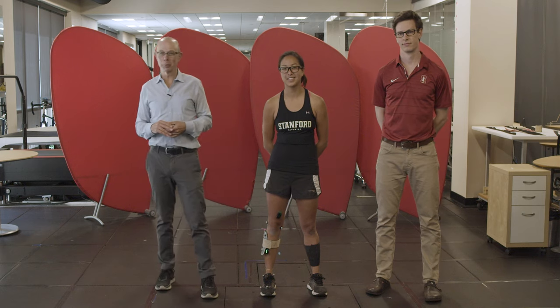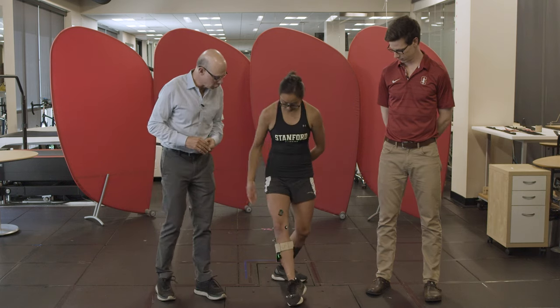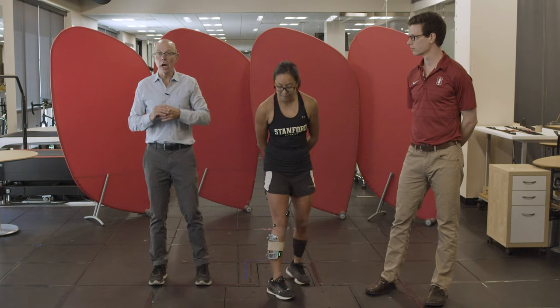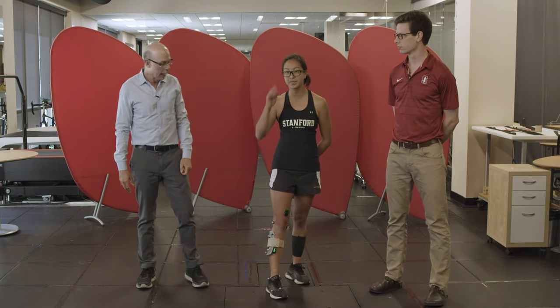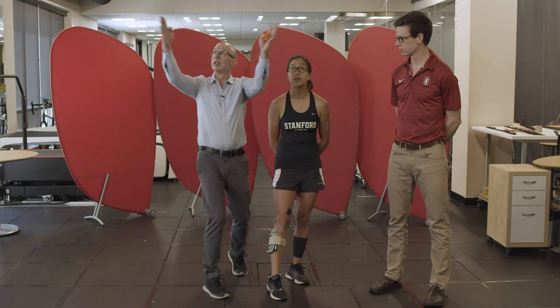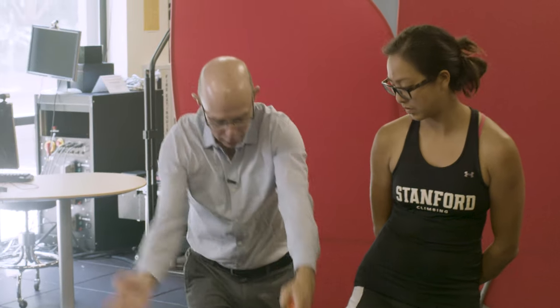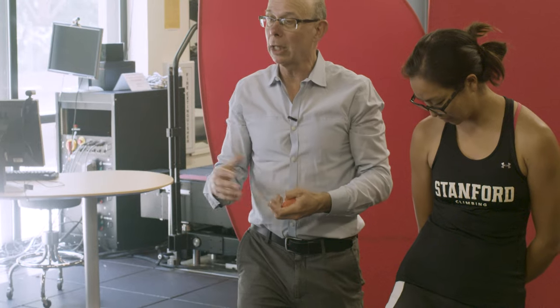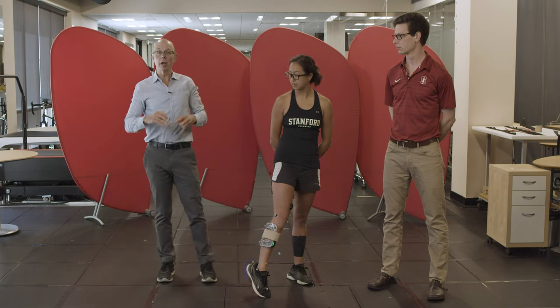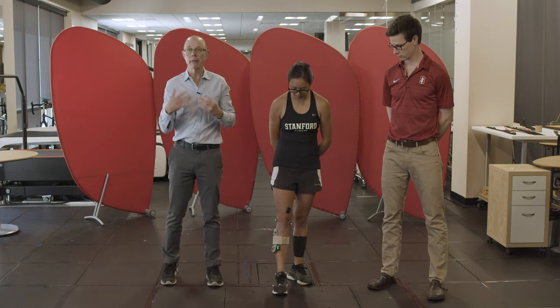We're going to do an integrated motion capture experiment. Hannah is in an outfit with optical motion capture and wireless EMG sensors. She has the tracking coordinate system and the anatomical coordinate systems. We've done a static calibration so we know her body position. The optical motion capture markers are tracked by several cameras around the room. When a marker is seen by two cameras, algorithms triangulate the position and give us the 3D coordinates of those markers. So we have combined 3D motion capture, EMG, and ground reaction force — all of that equipment being used together.